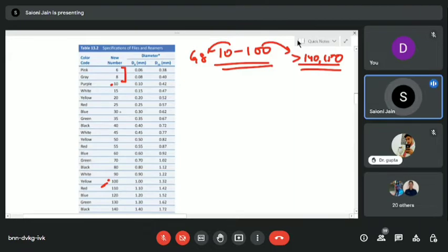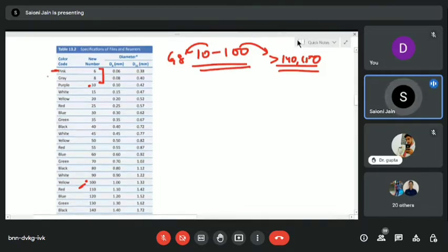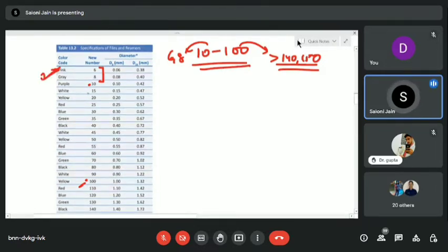Now this is the color coding that is there, and a trick to remember this, if you have confusion, if you can remember like this it's fine, but a trick is, see, it's going to start with pink because endo is a female dominated department, basically what we have seen. So it's going to start with pink. You can remember that it starts with pink because endo conservative is a female dominated department when it comes to PG basically. So pink is the first thing. And numbering you can write 6, 8. Numbering now you know, because you have 6, 8, 10, 15, 20. So first you mention the numbers. Then you start with pink. Then it's gray, purple, white, yellow.